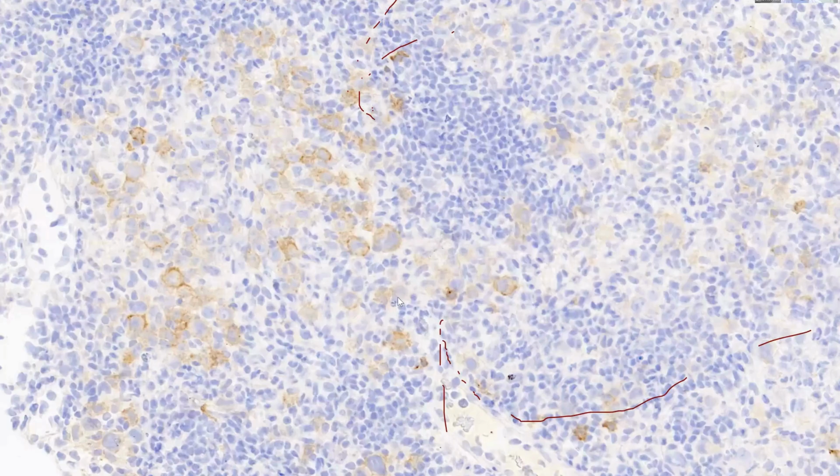But you can see it's a variable degree of expression, with some larger cells totally negative for CD30. And if we look at CD20, it's diffuse. It's highlighting all the cell population, all the larger cells, forming sheets of cells. So this is considered a diffuse large B-cell lymphoma.